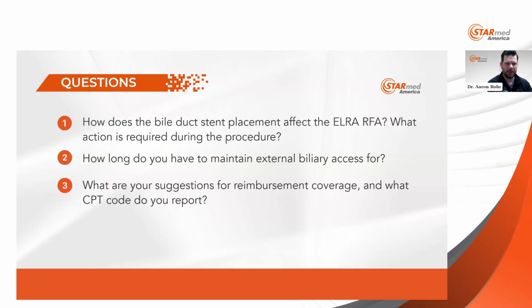Yeah, so these are some of the questions that we thought were pretty pertinent just right out of the gate. So how does the biliary duct stent placement affect the RFA if action is required? Intra-stent stenosis with the RFA system is not well explored in my realm at all, because our hospital, for a multitude of reasons, likes to stay pretty stent free as far as what we place, in that biliary tree stenting, if you will.